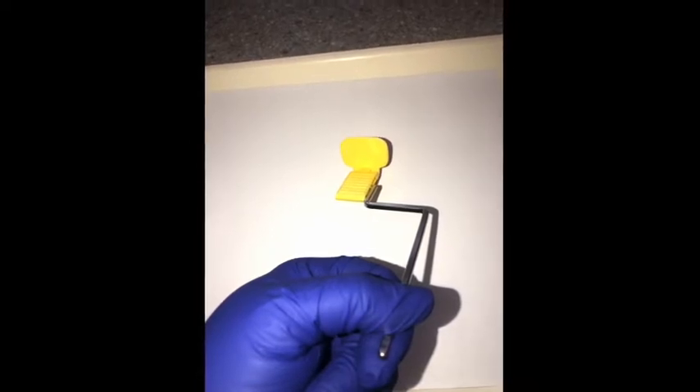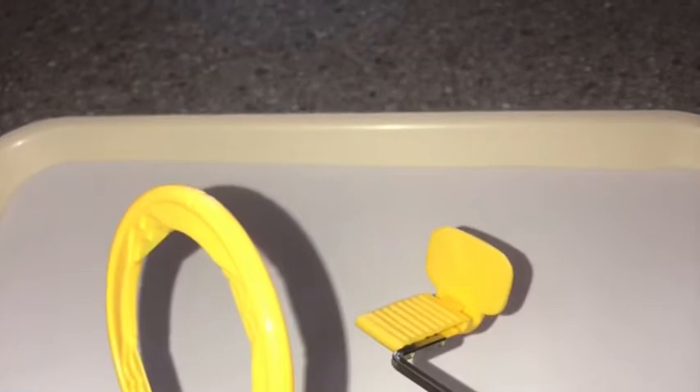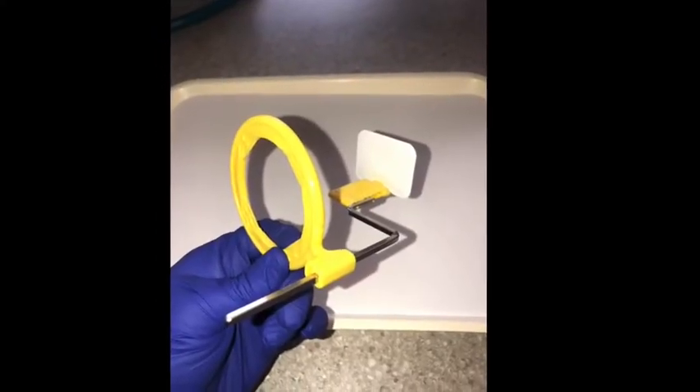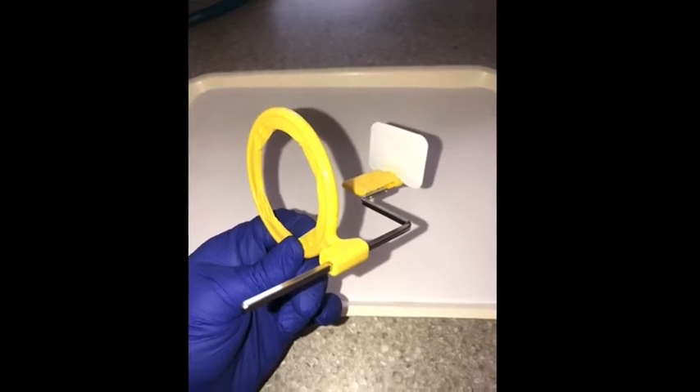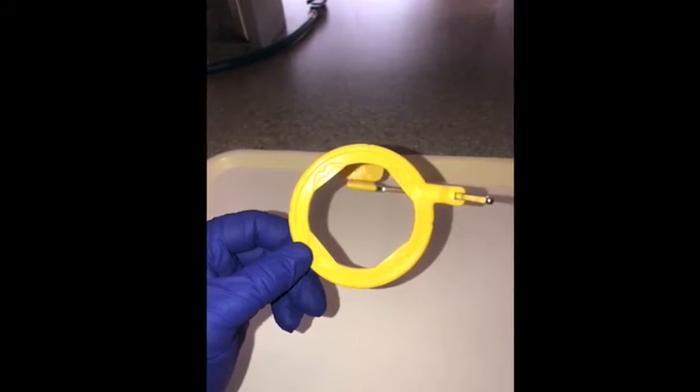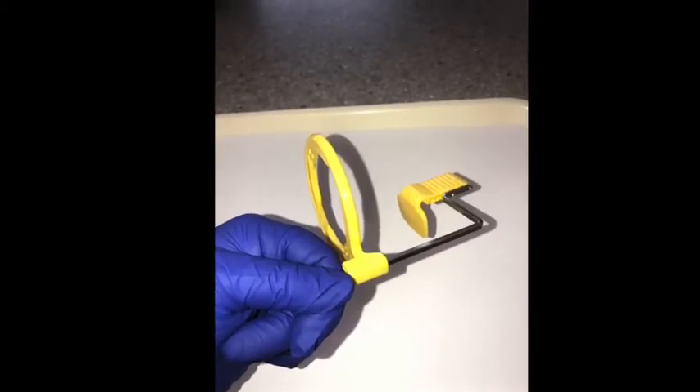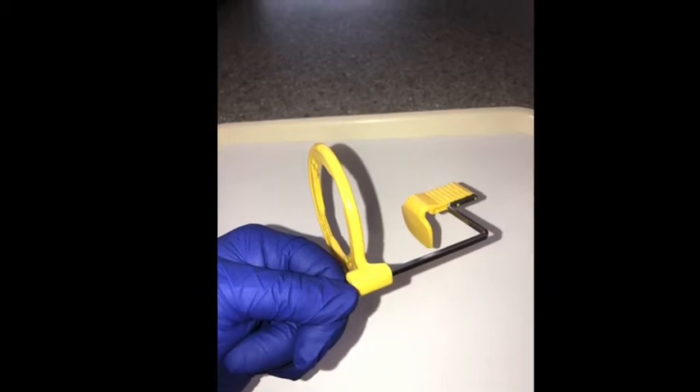This is the bar with the bite block assembled. When you have the ring assembled correctly, you should be able to look through the ring and see the bite block centered. If it's not centered, you may have the ring backwards. This is the periapical XCP for posterior with the film — this would be incorrect. Notice how the bite block is not centered in the ring. Here is the bite block flipped around and reversed, so that is incorrect as well.